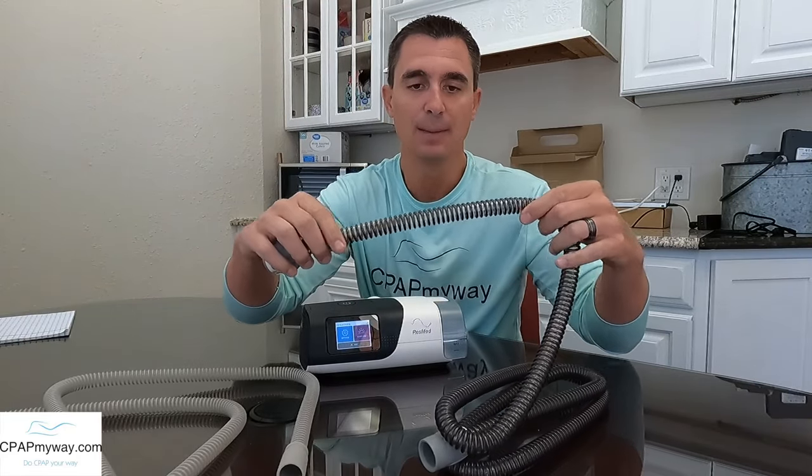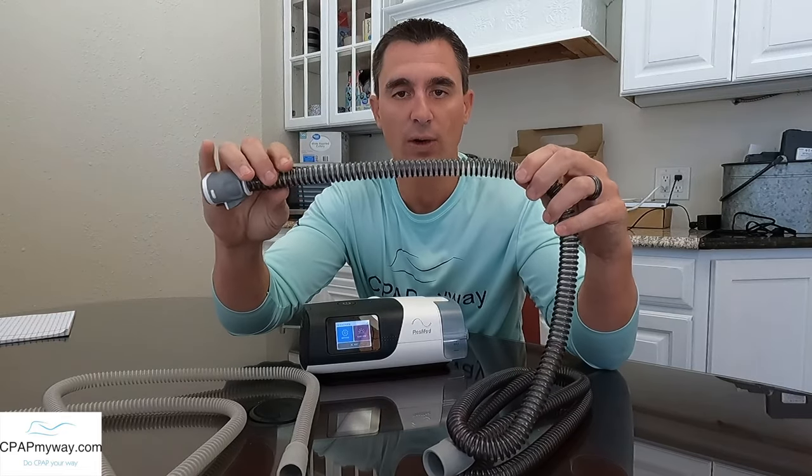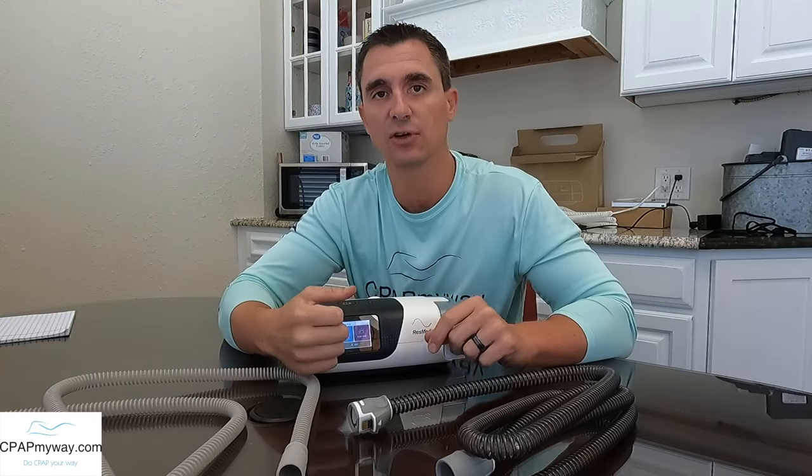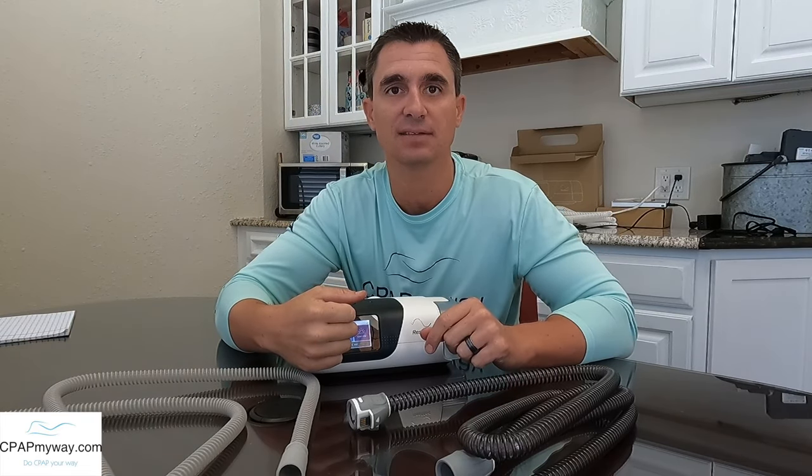The last thing you'll notice about the heated tubes is that they're not quite as flexible as these slim tubes. These things kind of wiggle and wobble all over the place, but because heated tubes have a heated coil in there, they're much more rigid, so it does get rid of some of your ability to move around freely. It can also affect the swivel on your mask a little bit, making things a little stiffer moving from side to side with the CPAP mask.